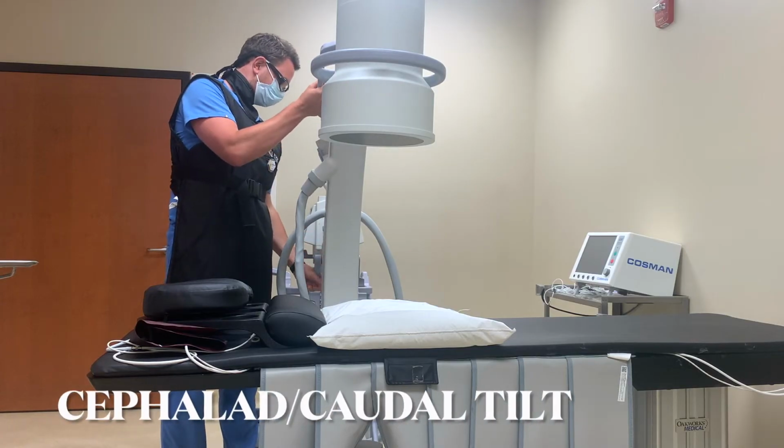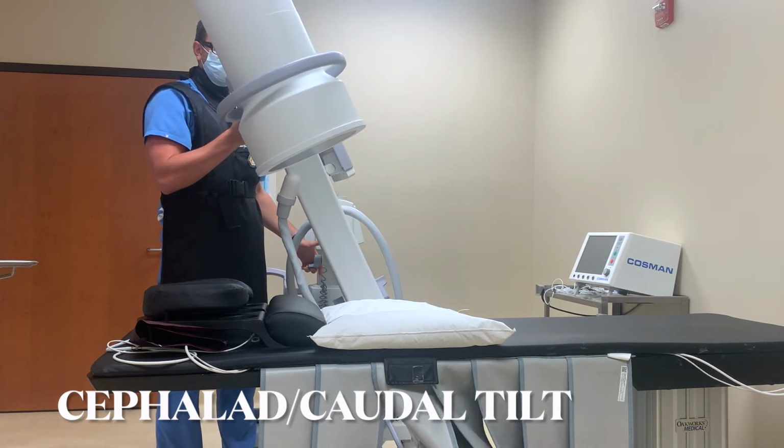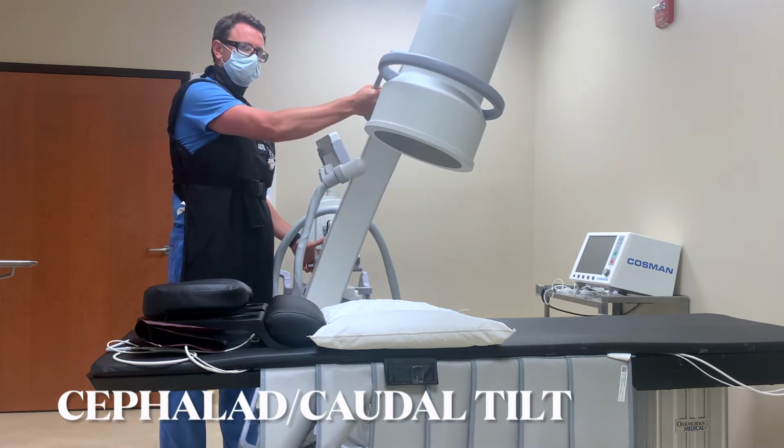The first movement we will display is a cephalad or caudal tilt. This is when the C-arm rotates around a transverse axis either towards the head, cephalad, or the feet, caudal, of the patient.